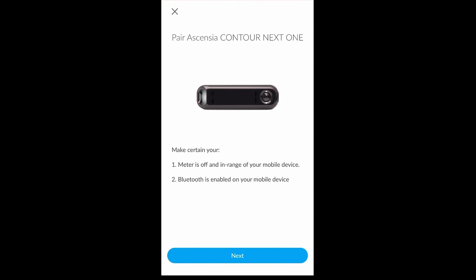Next, you will see on-screen instructions that are tailored to the specific device that you would like to upload. Please note that these instructions will vary from device to device depending on the steps required in order to upload.